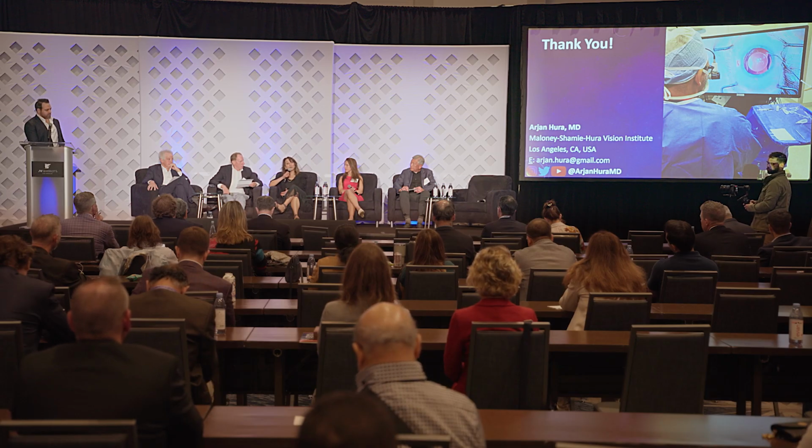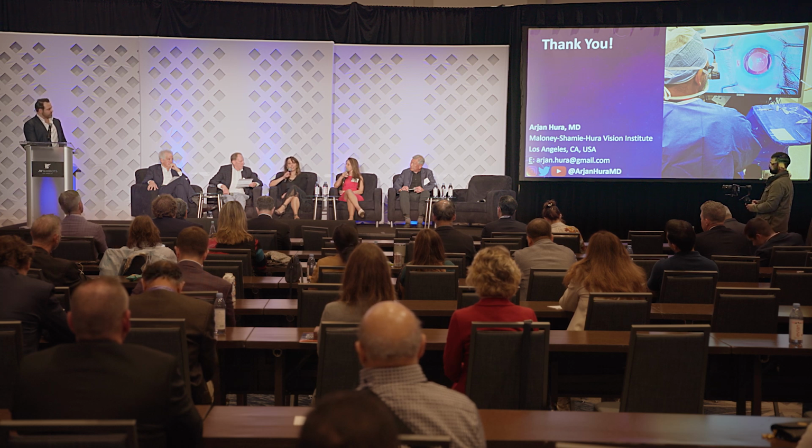The other key thing is to have them come in around the same time for their manifest and adjustments, because as we know with post-RK, they can fluctuate depending on how many cuts they have. So if one visit is in the morning and another one in the afternoon, you're going to be chasing a moving target. And these patients should know that 20/20 is not the goal. It's 20 happy, and that this is a lens technology that can get them closest to their target only if they have a regular corneal curvature and measurements.